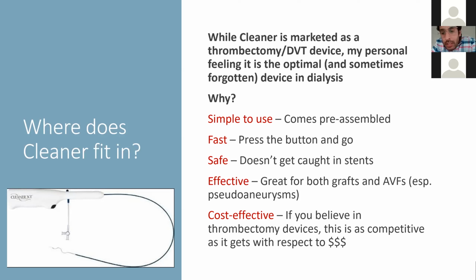So that gets to the core of the question, I think, which is what do we do about the PEs that we cause? If you're using balloons, you're probably lacing the clot with TPA usually. And there is literature that shows that the PE that we cause from doing repeated declots does not lead to chronic pulmonary hypertension, which is interesting in itself.